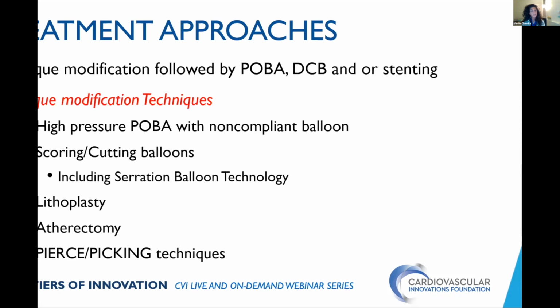We've discussed a few of these, and I'm going to show a couple of examples, and we've already seen some examples. Lithoplasty, of course, we've already seen. Atherectomy, and I'm going to show a couple more studies. There's scoring and cutting balloons, including the serration balloon technology, which I think is a particularly exciting one, and I have a case on that I'd like to discuss. High-pressure POBA. And have you guys heard of the pierce and crack technique?